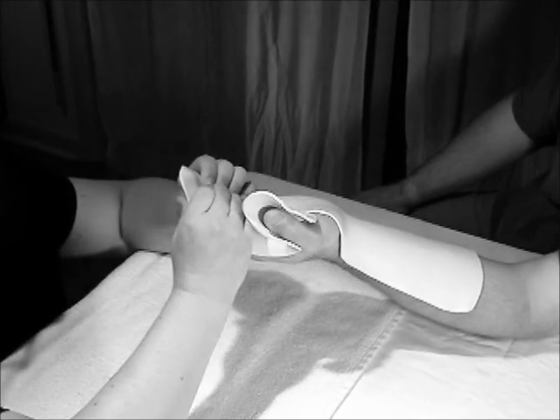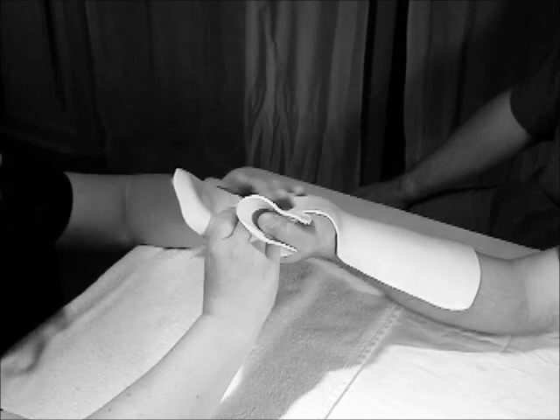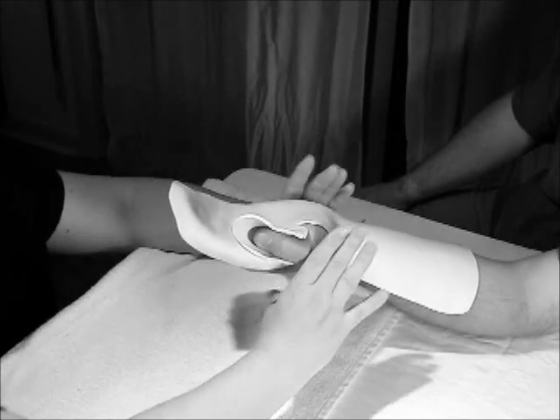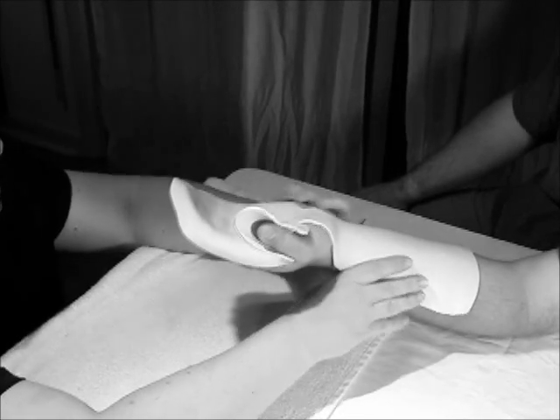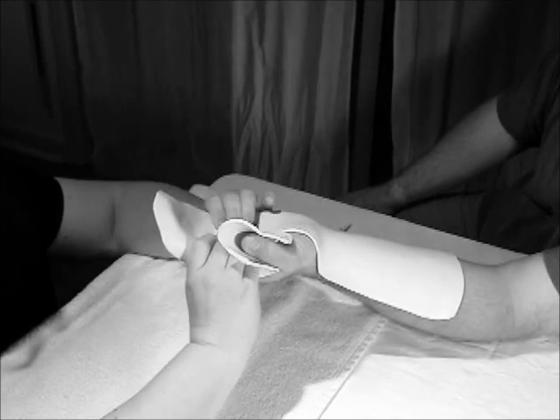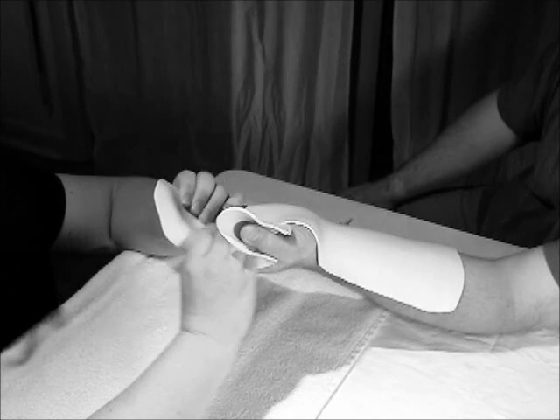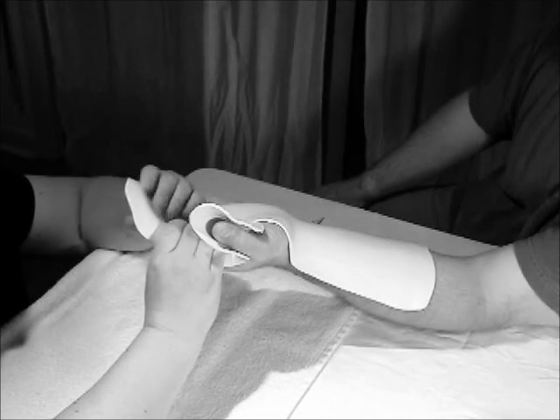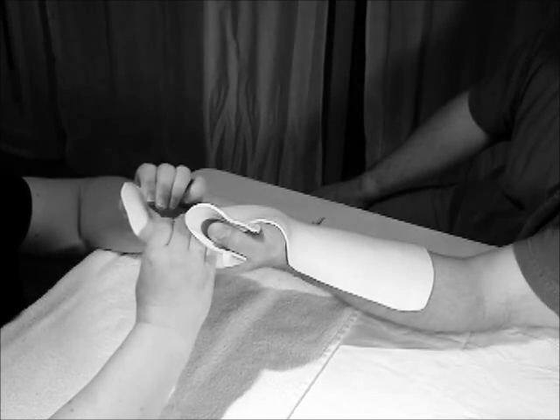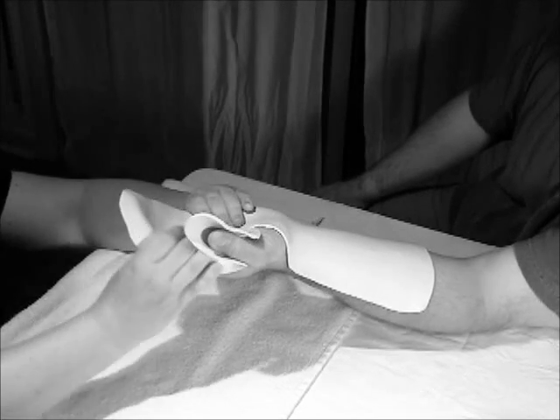If it was a CVA or a stroke patient that you're making the splint for, obviously they're going to have a lot of flexor tone. So what I like to do is just make the wrist component first, and then ace wrap that on, and then I do the thumb and the hand component second. And I don't use the Tailor Splint, I use the Orthoplast because it's a little bit firmer and it's going to hold the tone a little bit better, and you can also put some dividers here.